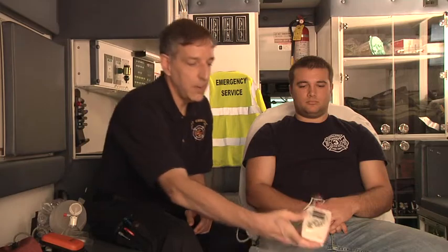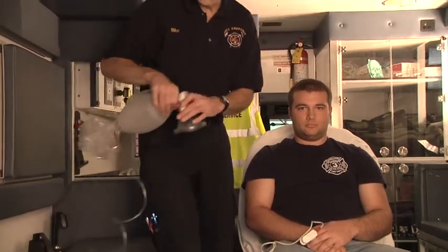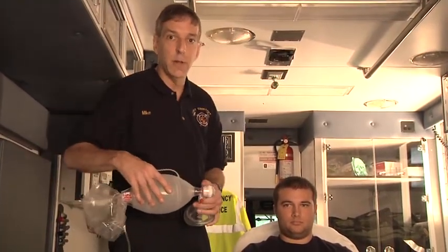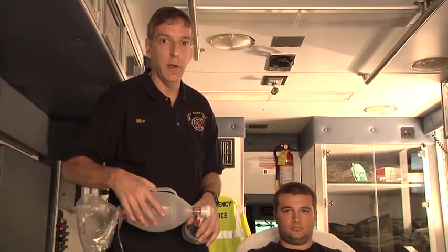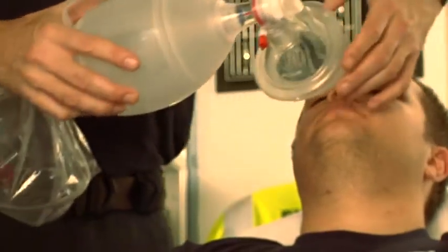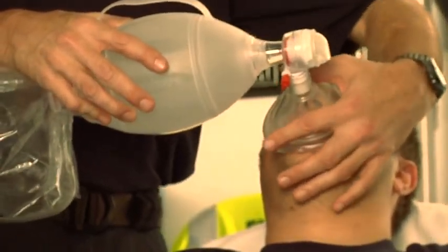To ventilate a patient who's spontaneously breathing, we're going to take a bag valve mask connected to an oxygen source. If you don't have an oxygen source readily available, it's fine to begin ventilation with room air. We're going to place the mask in the cleft of the patient's chin and lay the rest of the mask over the top of their face.